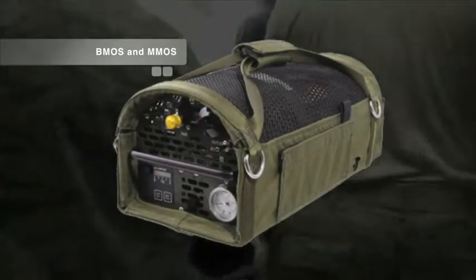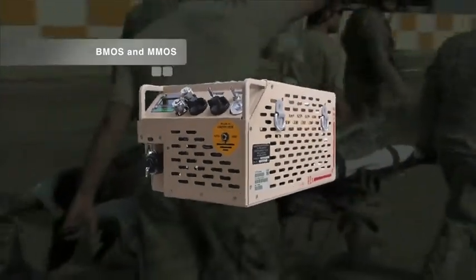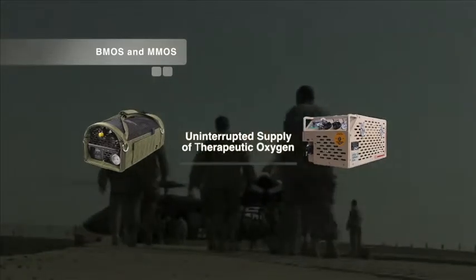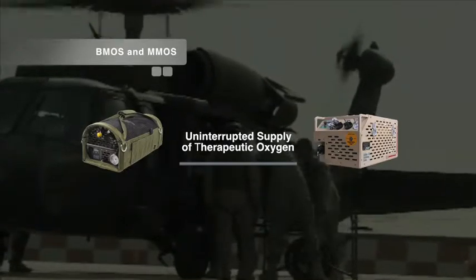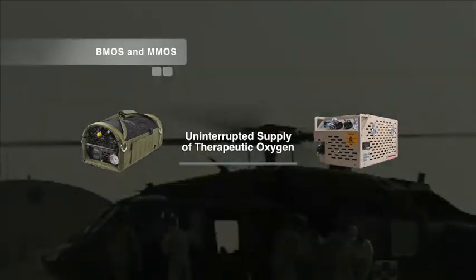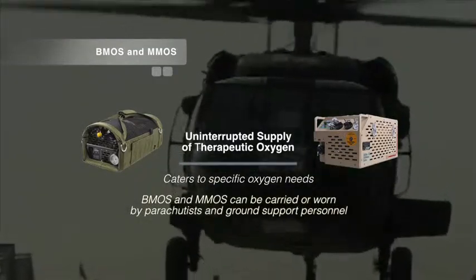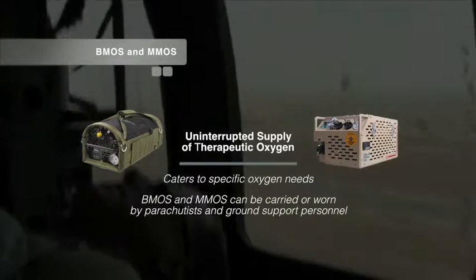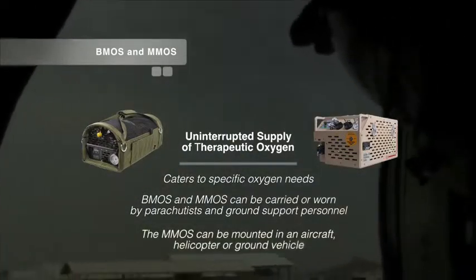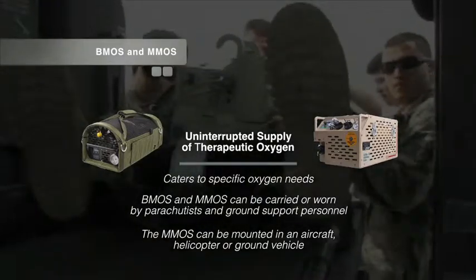The BMOS backpack medical oxygen system and the M-MOS mounted medical oxygen system provide an uninterrupted supply of therapeutic oxygen when filled with liquid oxygen. These units were designed with the user in mind, each catering to specific oxygen needs. The BMOS and M-MOS can be carried or worn by parachutist and ground support personnel. The M-MOS extends those transport capabilities by being mounted in an aircraft, helicopter, or ground vehicle.